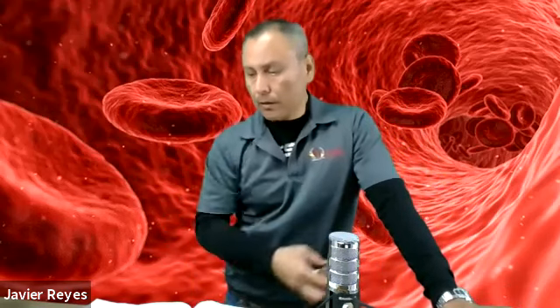So how do we collect newborn screenings? We collect them by using what they call a blood spot collection.